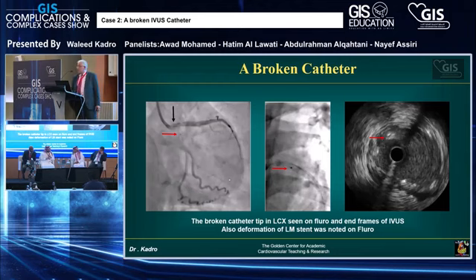I think this happened after you tried to pull it out from the left circumflex, because some struts are there in the left main, and you didn't land in the ostial LAD because there was disease extending to the distal left main.